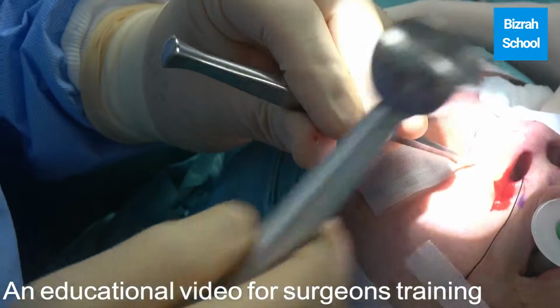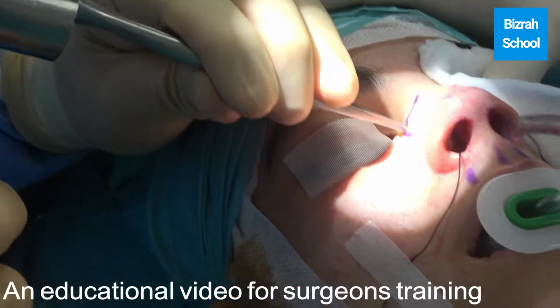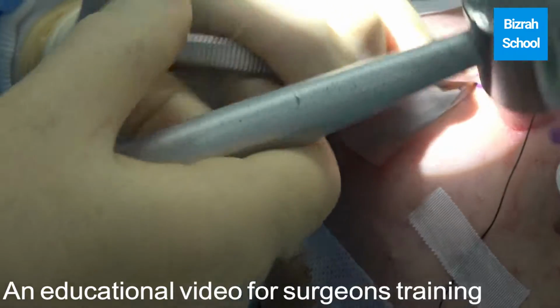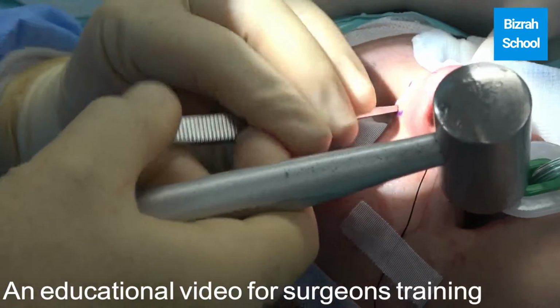Here we don't need to do mid-lateral because this bone is short, the other bone is the longer one. See? I'm not getting through the whole compartment of the bone. It's like exactly pressing on the eggs. Okay, almost we have done.